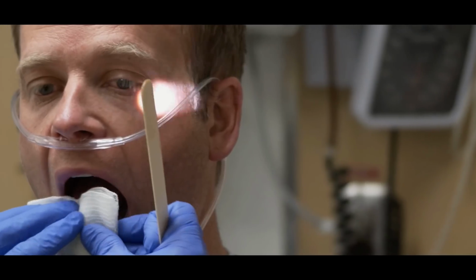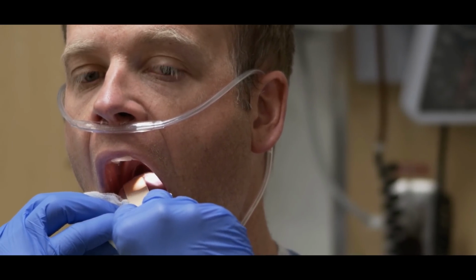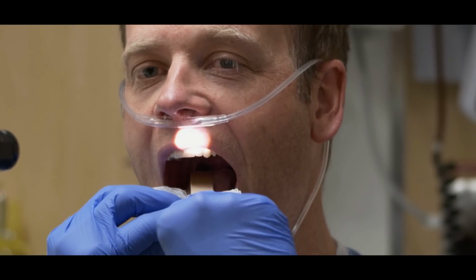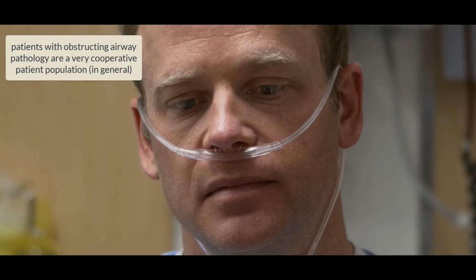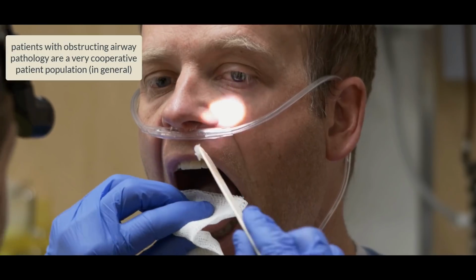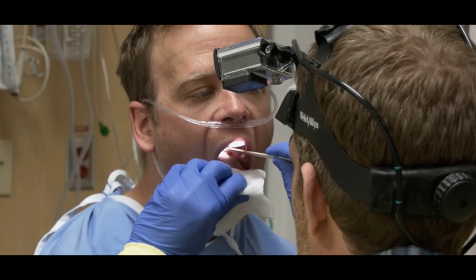If you can stick your tongue out for me, Chad, thank you. Stick your tongue out there, Chad. Thank you. And we're just gently massaging that in.